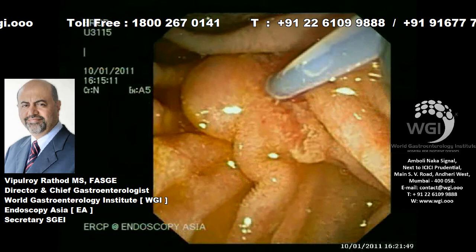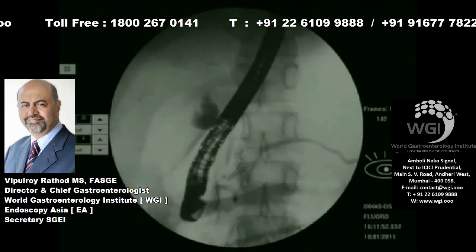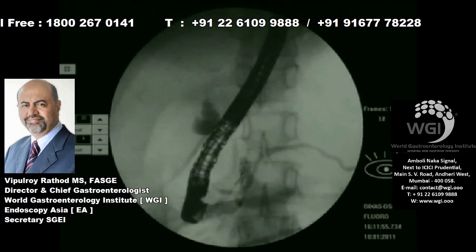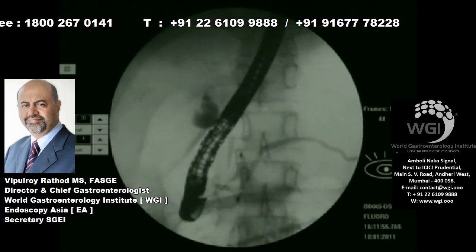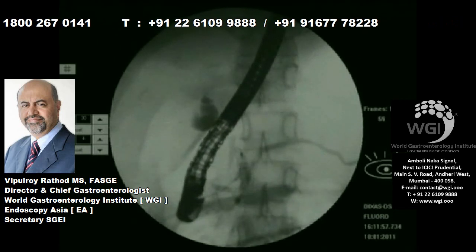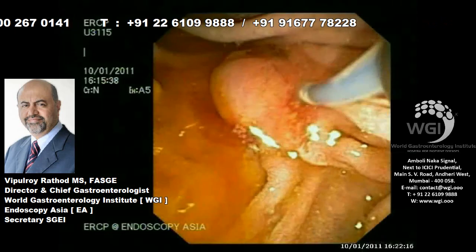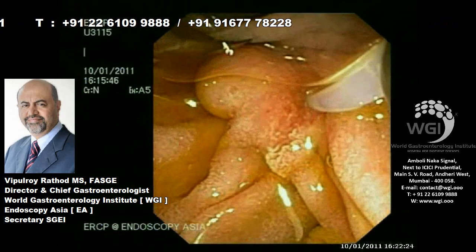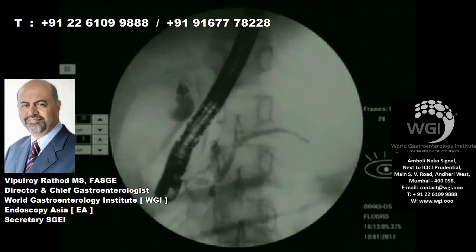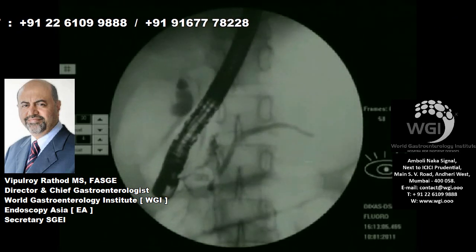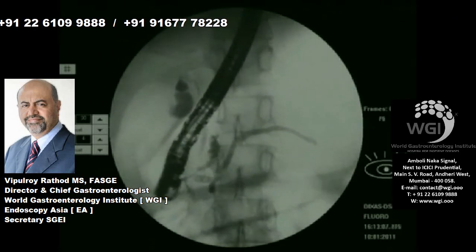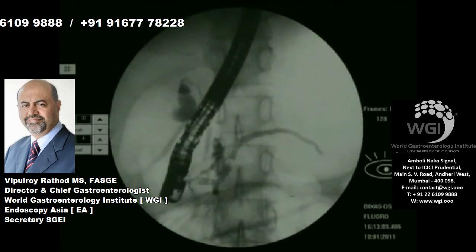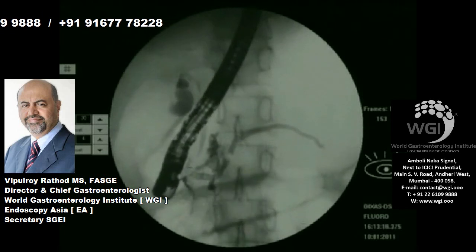Our guide wire is in what we call the accessory duct, which we saw earlier. There is pancreas divisum for sure. We are obtaining a pancreatogram, and there is some communication — that is why the duct is filling up.